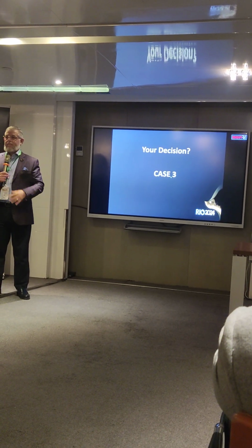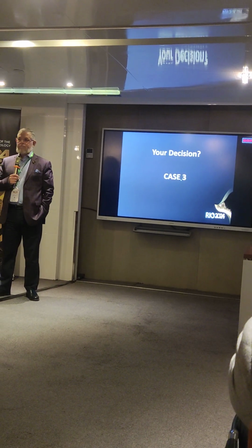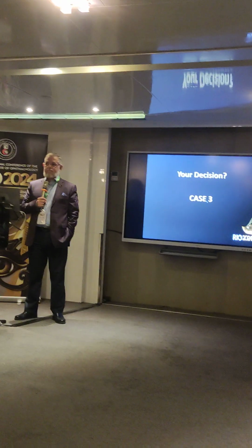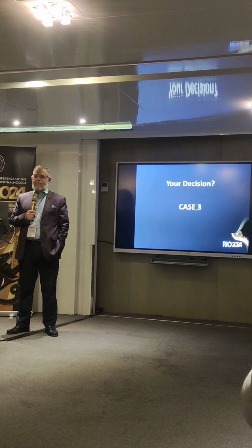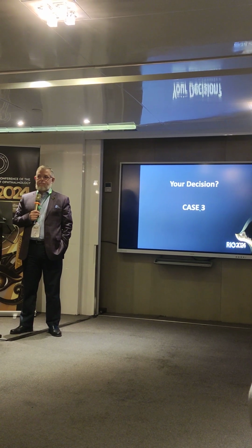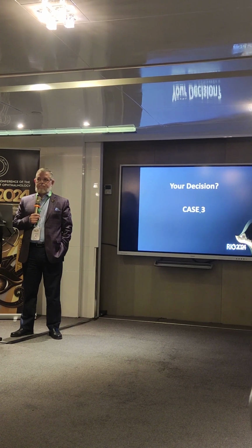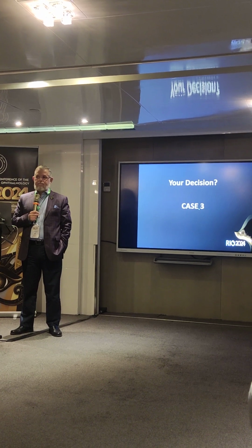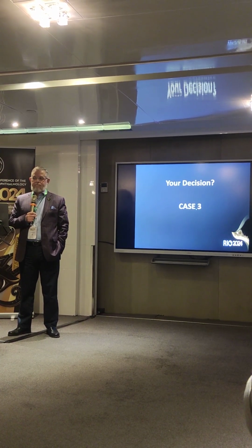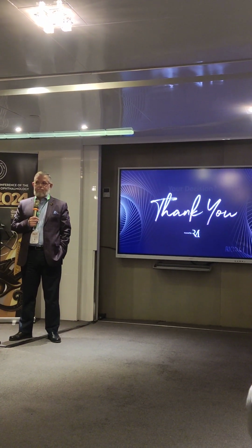Yes. Now, positive spherical aberration and negative spherical aberration do not necessarily increase the depth of focus. There was a landmark study done, I think in Cleveland, that was an optical bench study, and they showed clearly that spherical aberration of plus or minus 0.2 is the sweet spot that gives you very good depth of focus. And this was coherent with our clinical experience.